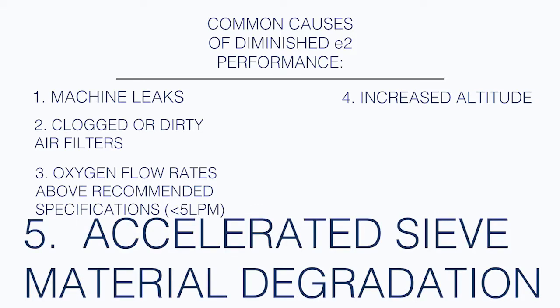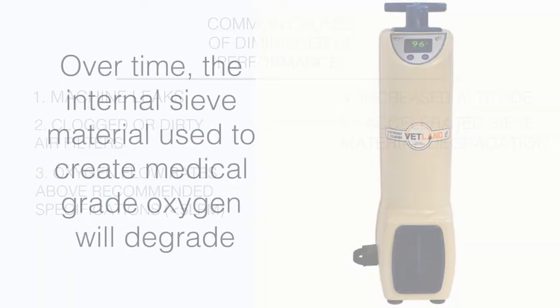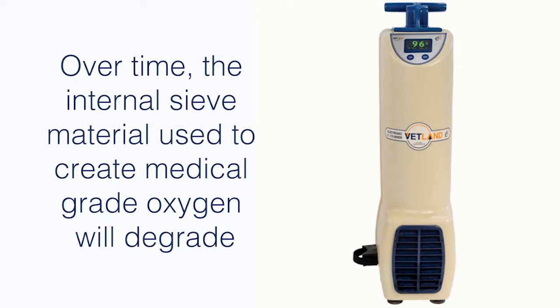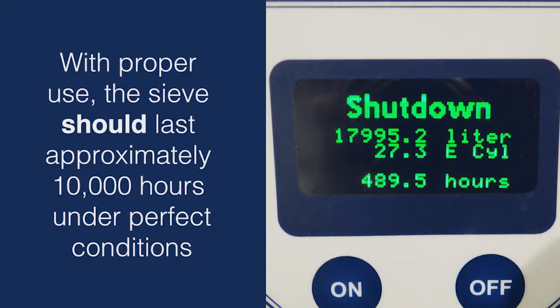Accelerated sieve material degradation. Over time, the internal sieve material used to create medical-grade oxygen will degrade. With proper use, the sieve should be able to last approximately 10,000 hours under perfect conditions.